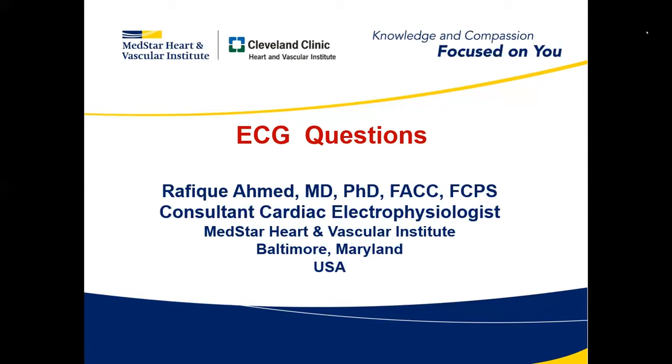Okay, but as usual, I have to disagree with Hafiz. Hafiz, don't go, stay on the screen. The problem is when somebody like Hafiz looks at a computer report, he has the courage to say no to it. But most of us, or the average person looking at the report, would say, well, I don't know much ECG, maybe the computer is correct. And in the learning phase, it biases us.